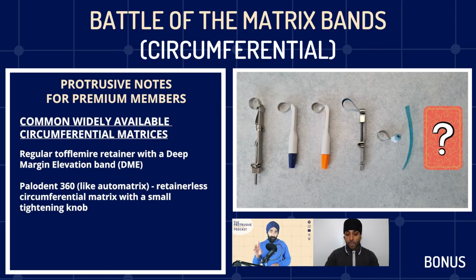See, that's the one that Instagram dentists are using. That's the one that I see the Instagram dentists favoring quite a bit, the Palodent 360. Have you noticed a trend that perhaps a lot of dentists are using that one in terms of what you've seen?